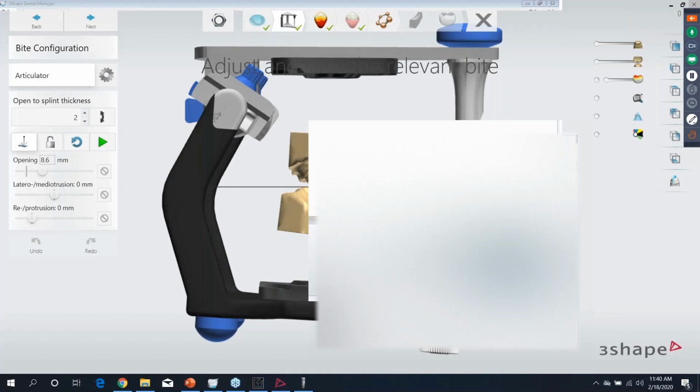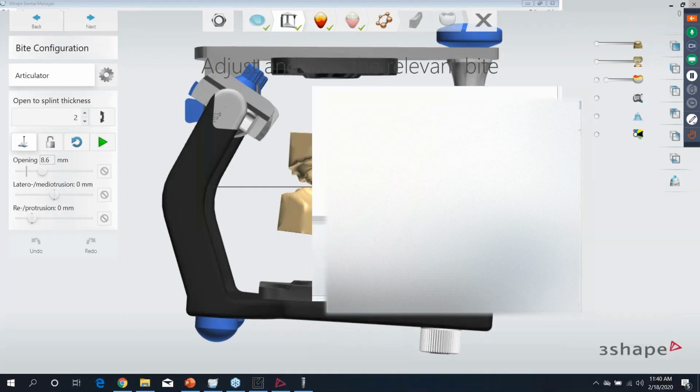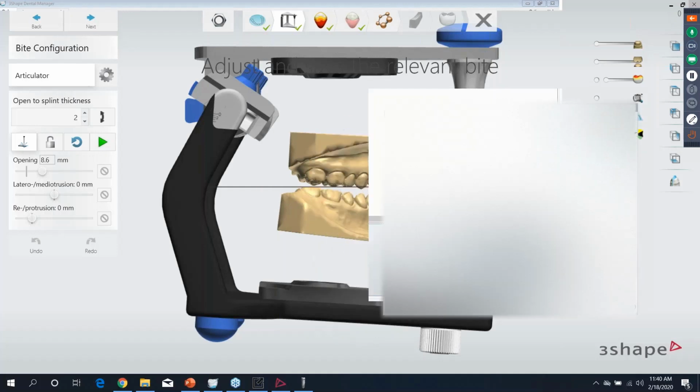That will work. How would we adapt for a hard soft reline? From Jake. I'm not entirely sure what you mean, Jake. If you could elaborate a little bit for me, I might be able to give you an answer on that. So we'll wait just a minute.